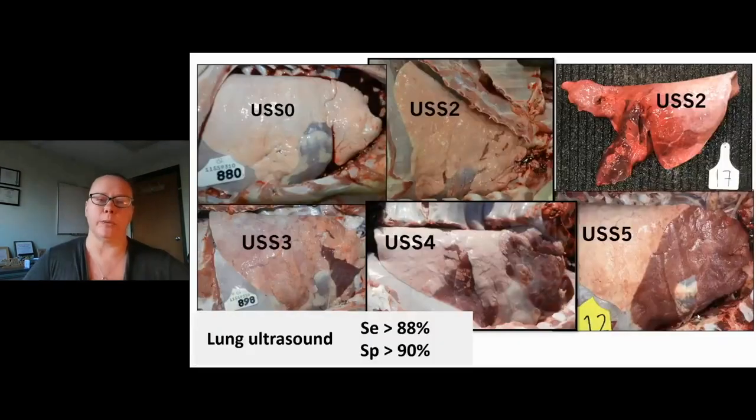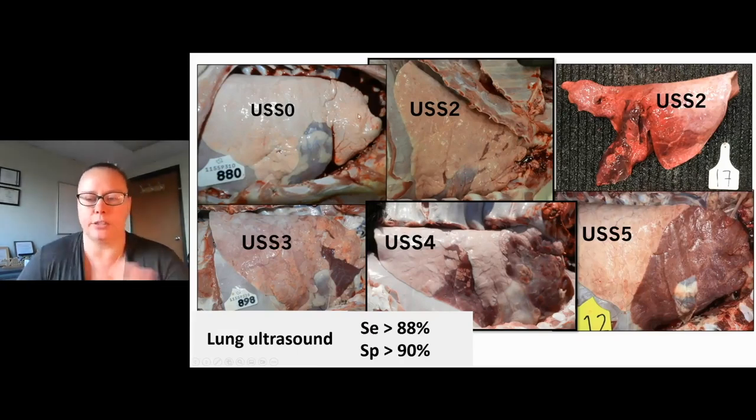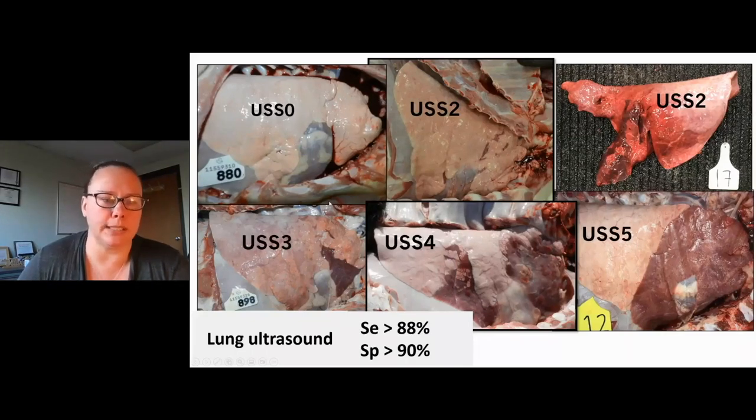All right. When I talk about the scoring system that I use, I referred to it earlier as score 0 through score 5, and I'll just show you what the lungs look like for each of these scores. So again, we're looking at the right lung oriented just like I showed you in that previous slide, where for each image, the head would be to the right and the tail would be to the left. The spine is up at the top of the picture and then the sternum is down here. So we're looking into that right lung.